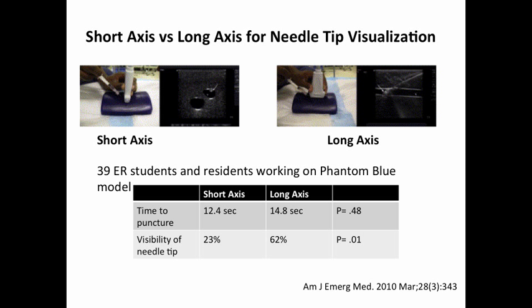Either you can put the probe down, put your needle in, find the tip of your needle, and follow the needle down the patient with the probe, or you can have the probe in the same exact place and angle the needle as you go. And this will be easier to see as we do our practicals tomorrow. But ideally, you should know where the tip of your needle is, because I've seen folks bury the needle completely when you know that the vessel is only 1 or 2 centimeters below the surface of the skin, and they're buried to like the full 4 or 5 centimeters. You're like going for an LP or something at that point. It's probably deeper than you need to be, and so it's important to keep in mind how far you're going.